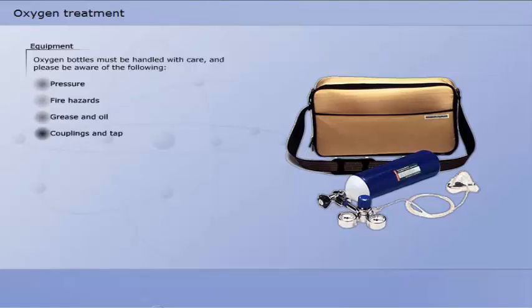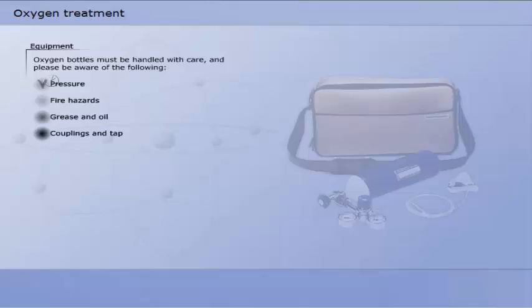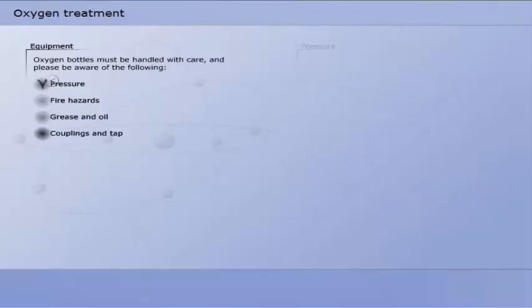Oxygen bottles must be handled with care and please be aware of the following: pressure, fire hazards, grease and oil, couplings and tap.